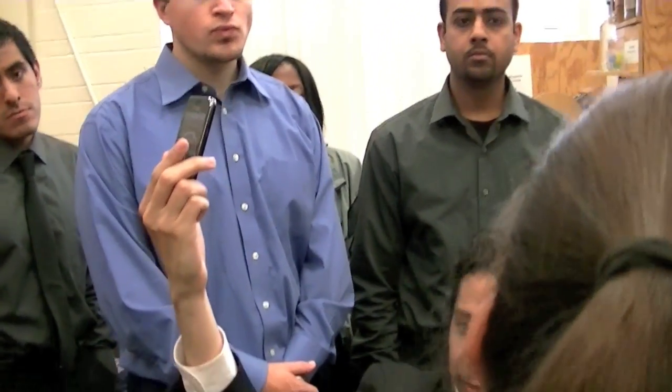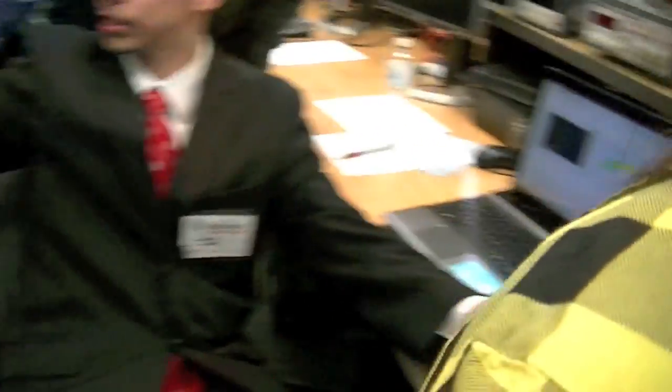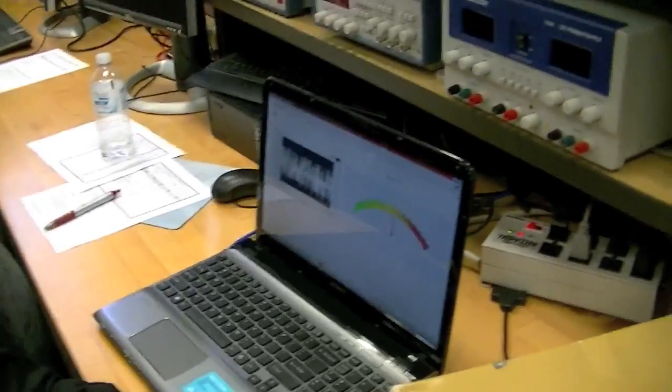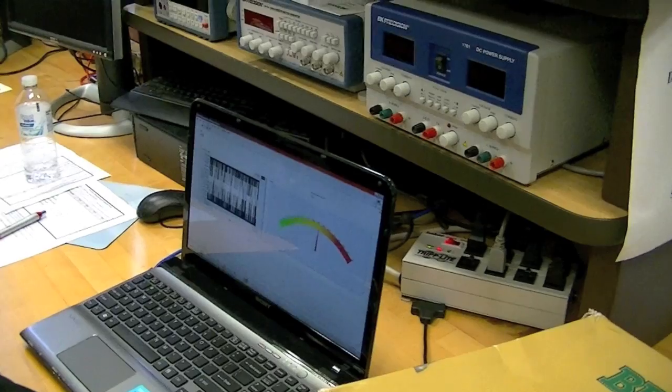Any other volunteers want to try? What's the reading right now? Right now it's at about 1.30. It's not fully calibrated, so the reading may not be accurate. She's okay, don't worry, you're fine.